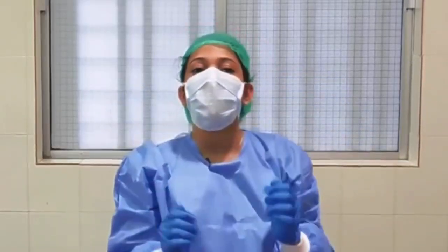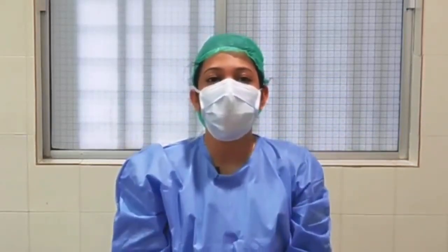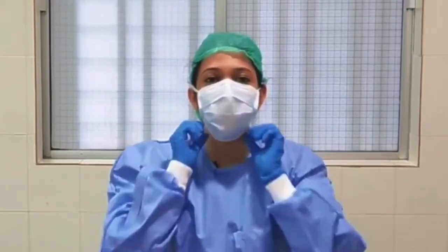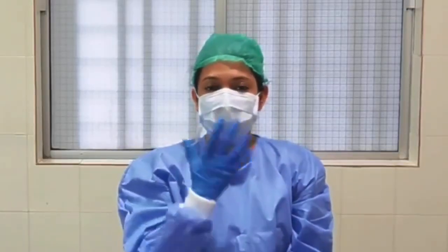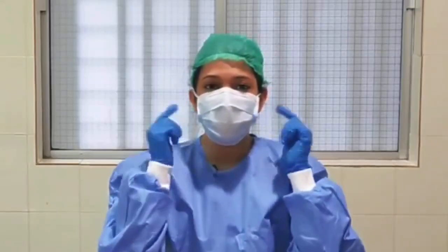Okay. And just exhale sharply and check whether air is leaking somewhere, and if air is leaking, tie the mask more tightly. But there are some disadvantages. Even though we use this mask, there is still a chance of the exhaled air leaking outside and infecting other patients.